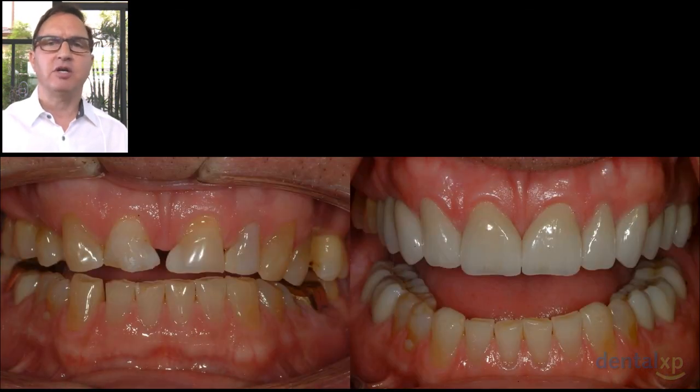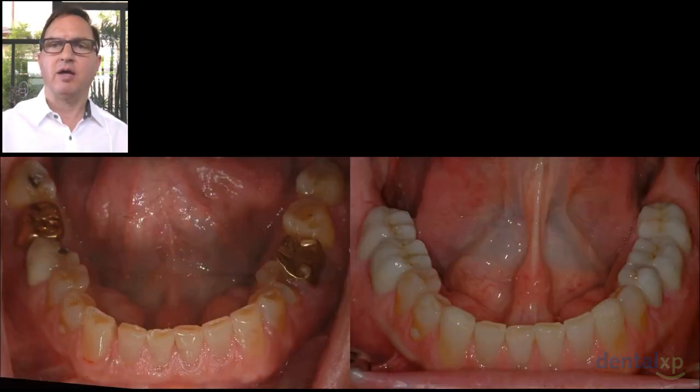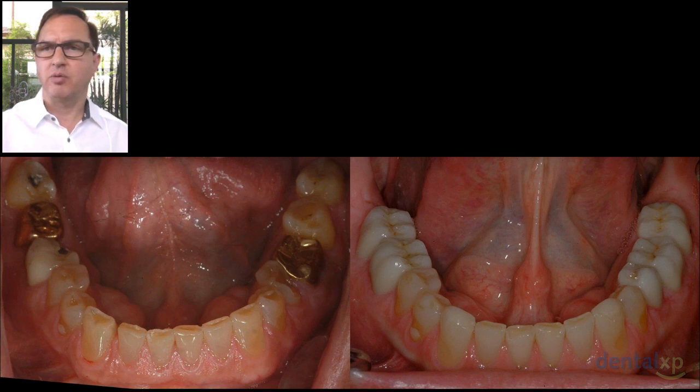By having that facial cutback, we have the opportunity to layer conventional feldspathic porcelain that's matched to the underlying zirconia ceramic, and in that we can impose the artistry that a master ceramist might like to achieve utilizing whatever medium possible. In this instance, we know that the ceramists do a great job with porcelain fused to metal, but we're using this new porcelain fused to zirconia with full contour occlusal zirconia.